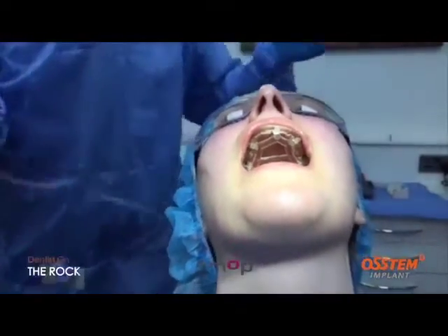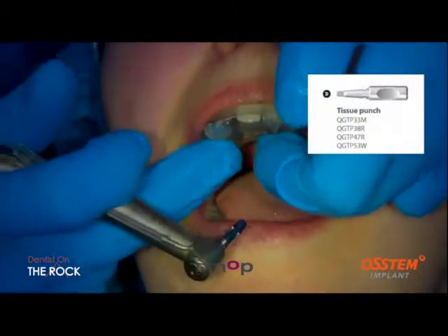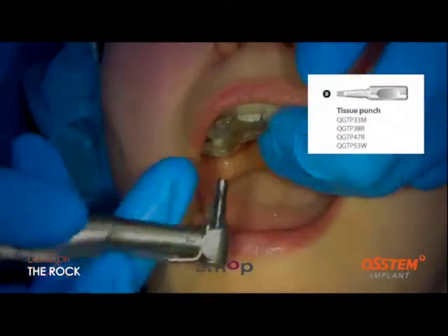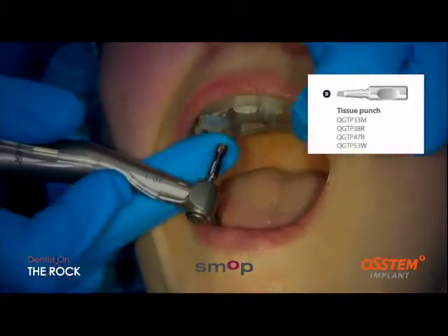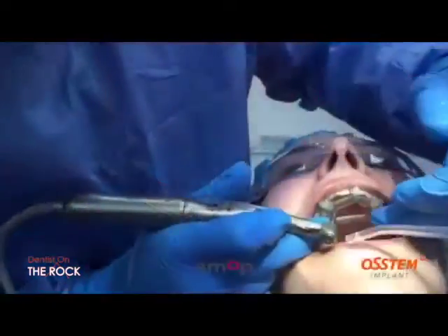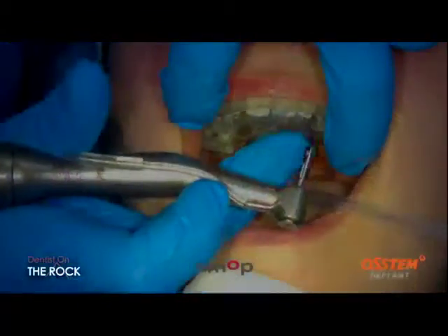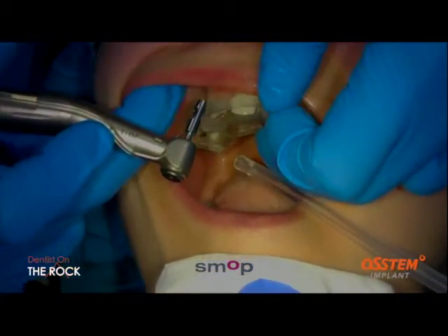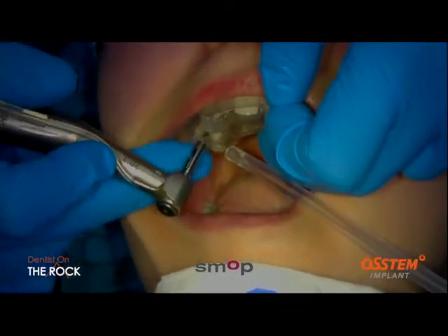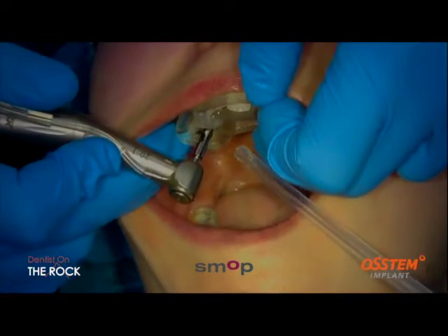Now, when I'm doing the tissue punch, at all times I love my finger rests. I'm going to try as much as I can to finger rest everything. Holding out the way, Janine's going to be catching all the water, but with the SMOP guide, and you've got the same at the bottom, you've got this arch connector here. I usually tend to use that as a rest because it's central to the placement of the guide. And if I hold that there and I'm using a finger rest for my drill, then I know that I'm going to support everything in a nice way.